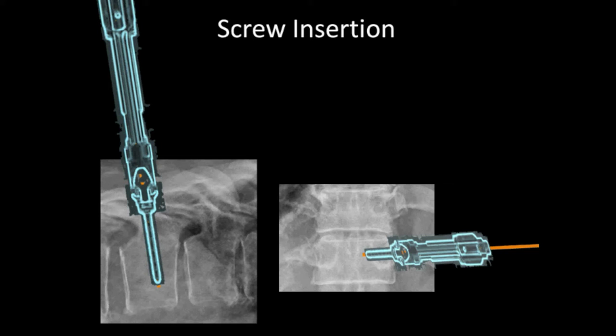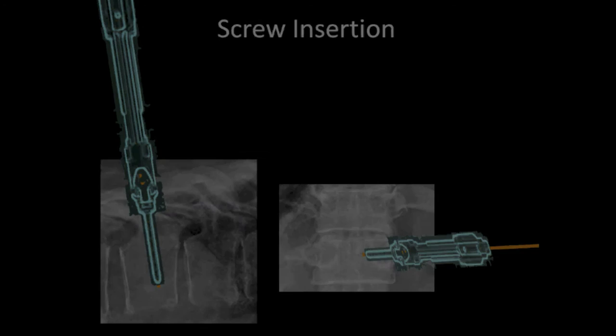The pedicle was prepared by placing a tap over the guide wire and through the dilation sleeve. The pedicle screw was then placed with its extender. Similar procedures were repeated for each pedicle.